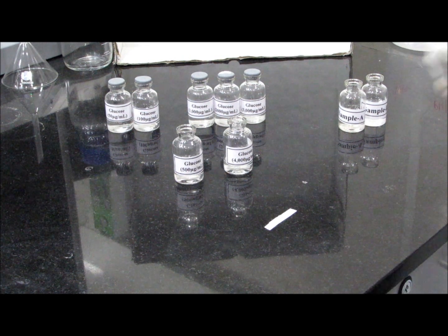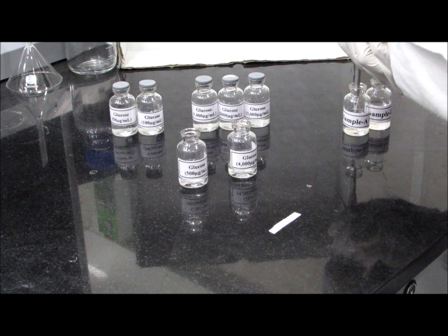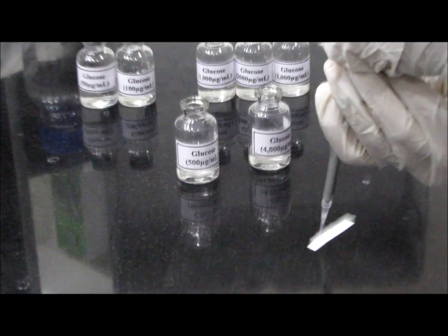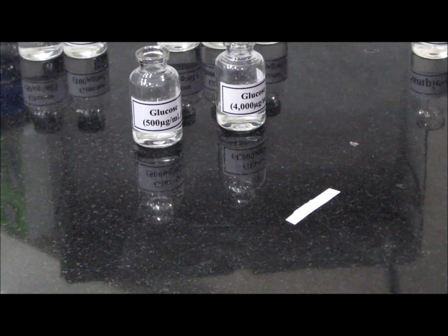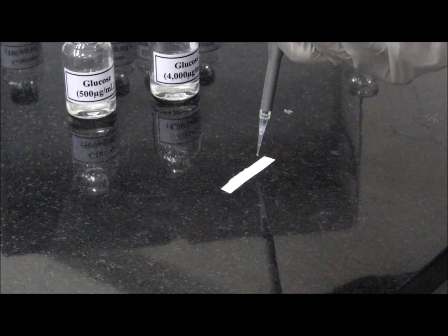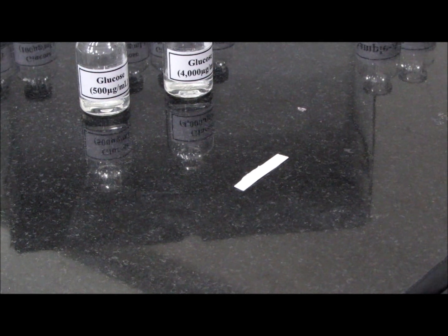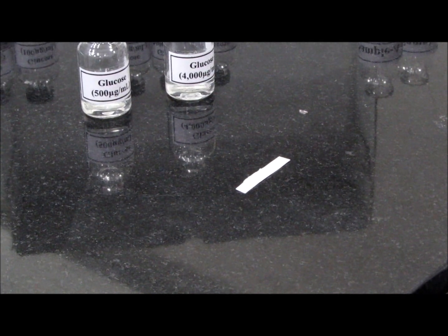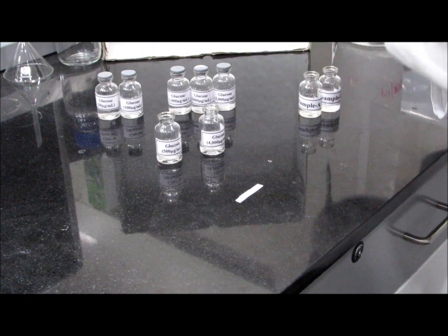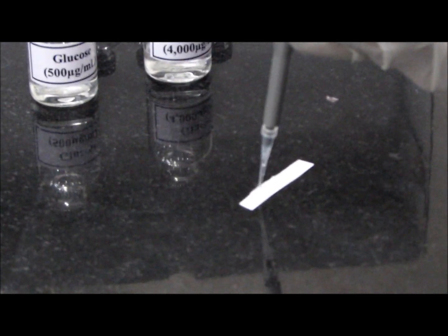Now I am adding 1 drop of catalyst solution which will oxidize the glucose. Now I am adding 1 drop of acetate solution, which will give the color intensity to the strip.